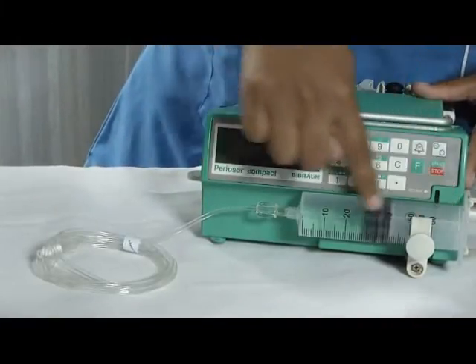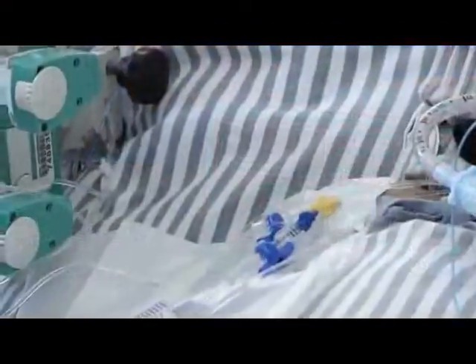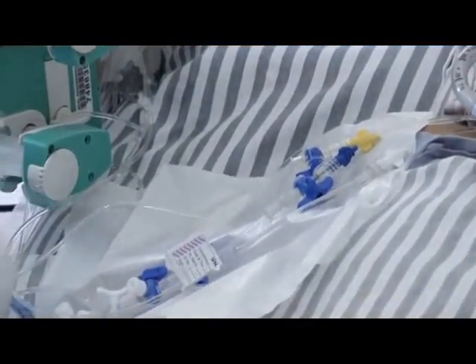This is the syringe which is connected to the tube, which pumps medicine to the patient via a central or peripheral line.